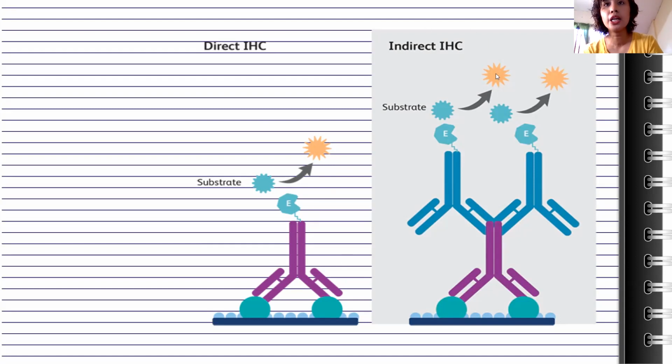Here, guys, in indirect immunohistochemistry, this is more robust, mas maraming characters involved. So these are your antigens or tumors, and we have a primary antibody. And this primary antibody, guys, does not have a label yet. The secondary antibody, the one that will attach to your primary antibody, yun ang may label. Sa indirect immunohistochemistry, ang may label ay yung secondary antibody, also called your second layer antibody. Ito yung first layer antibody mo.